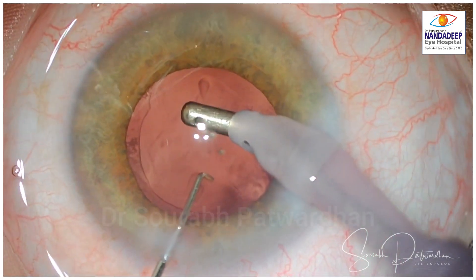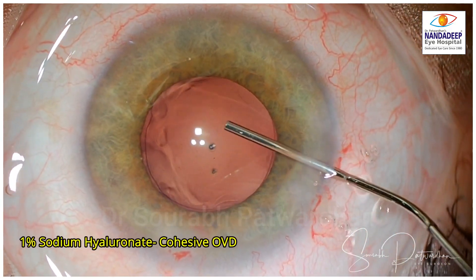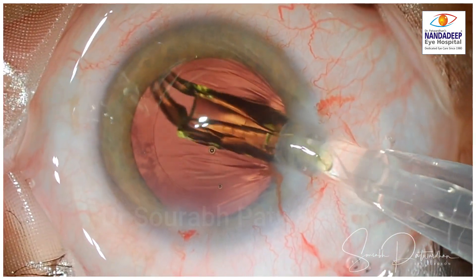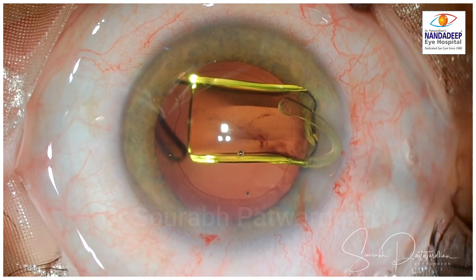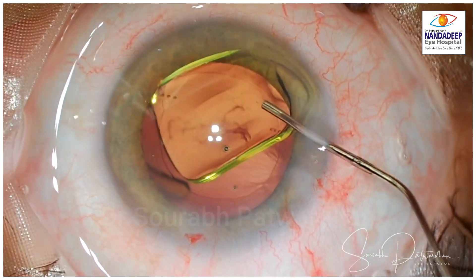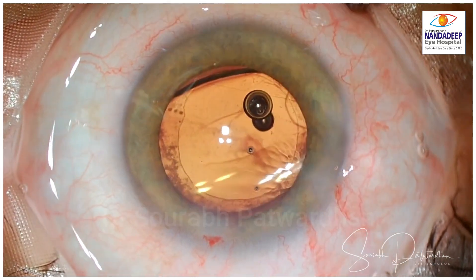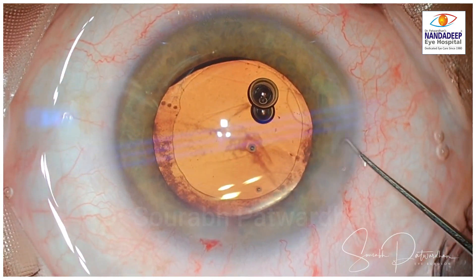I am going to use 1% sodium hyaluronate which is a cohesive OVD. For torics, I prefer this because the removal of cohesive OVD is easy. It is important to remove the OVD thoroughly, particularly in the case of toric IOL to avoid any rotational movement of the IOL in the post-operative period. This is a hydrophobic toric IOL. You can see those three dots on either side and the blue line which you see is the Calisto system showing the alignment of the toric IOL.